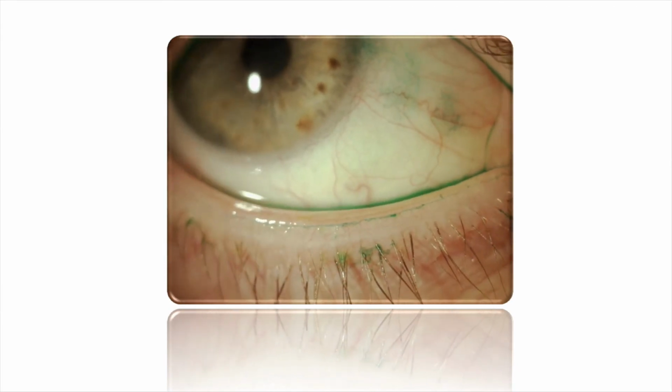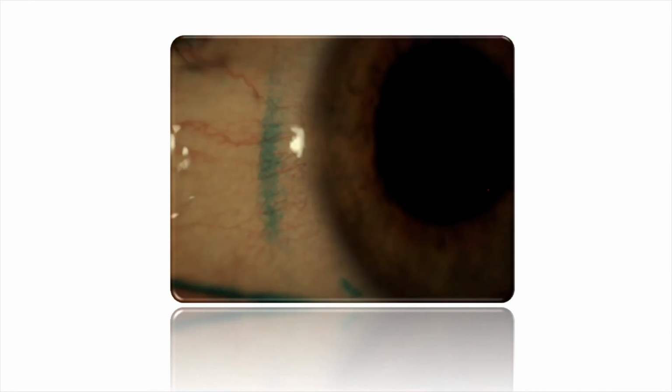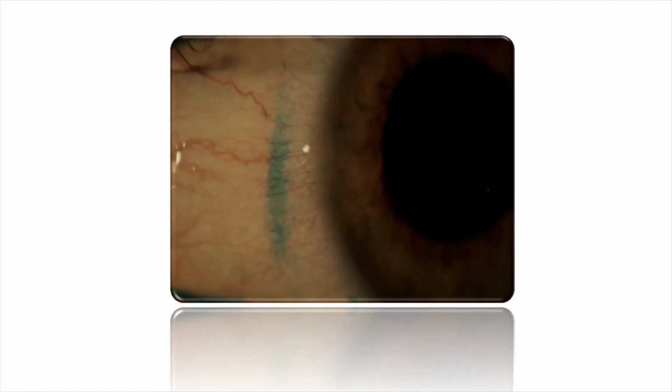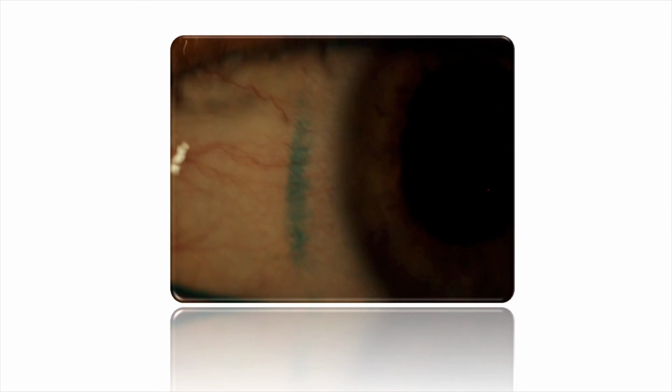First, we look to see if Lissamine green has stained the bulbar conjunctiva. In this case here, the patient is asymptomatic and happy with their contact lenses. If we didn't utilize the dye, we would have missed the dead or degenerative cells that you see here.